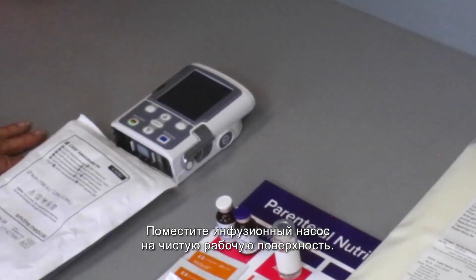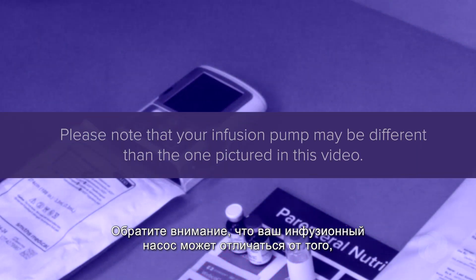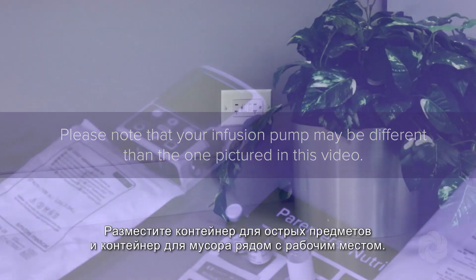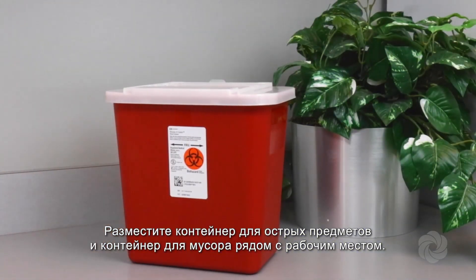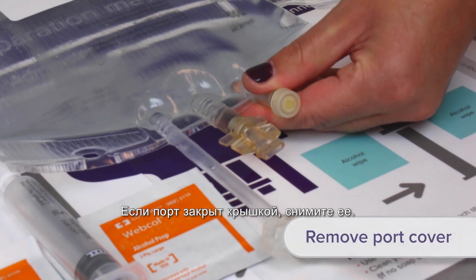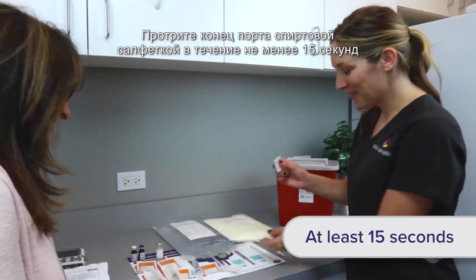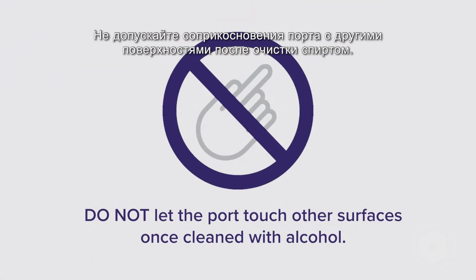Place the infusion pump on the clean work area. Please note that your infusion pump may be different than the one pictured in this video. Place sharps and trash containers near your work area. Locate the injection port on the clear PN bag. If there is a cover over the port, remove it. Scrub the end of the port with an alcohol wipe for at least 15 seconds and allow to air dry. Do not let the port touch other surfaces once cleaned with alcohol.